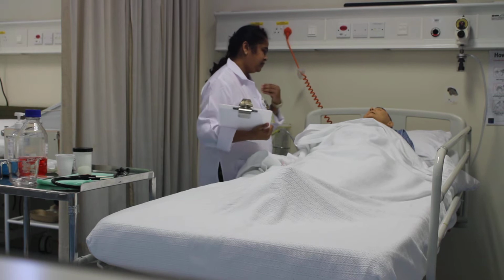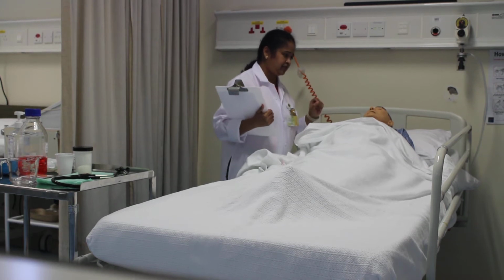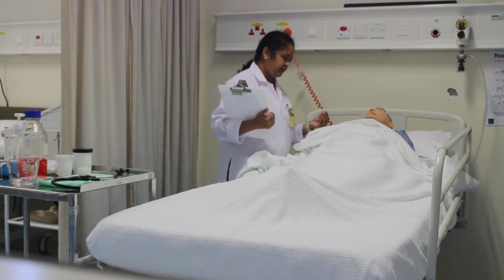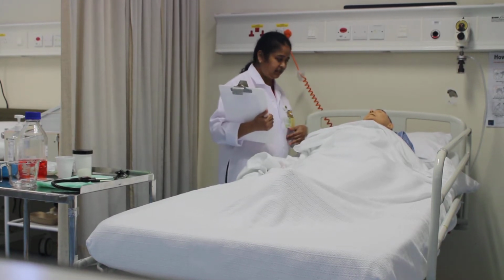Okay, I know you have some difficulty in swallowing. So the doctor has ordered for us to start you with NG tube feed. It is a tube which we will be introducing through your nose and into your stomach. A little discomfort will be there, but don't worry, we'll be helping you. We'll give you some instructions and then you can have it in an easy way.